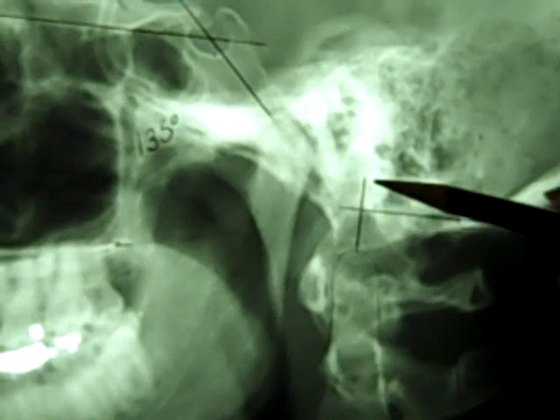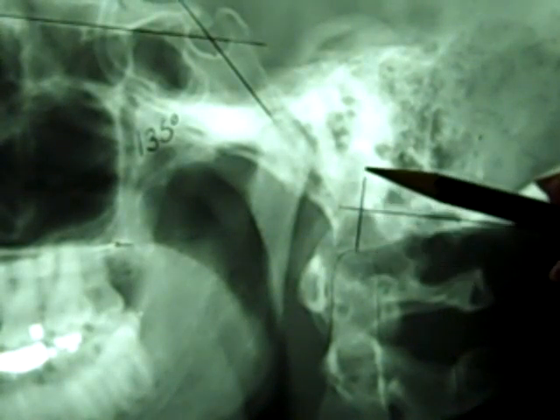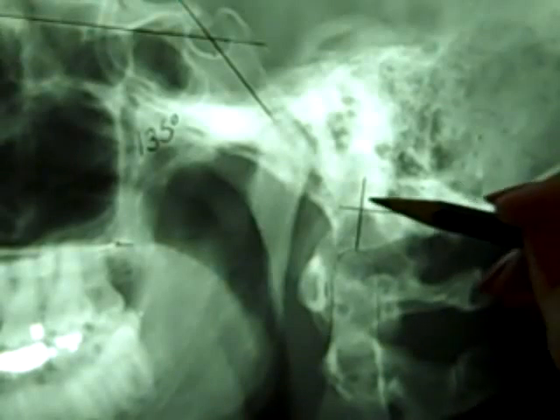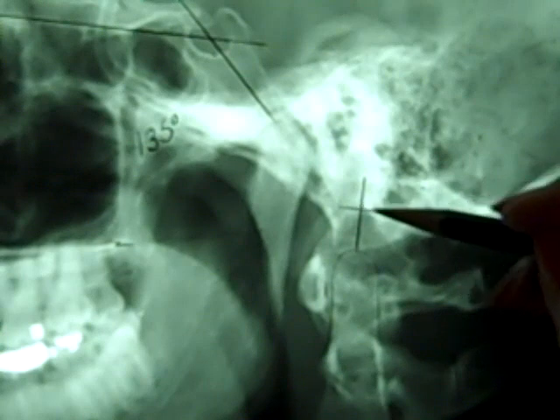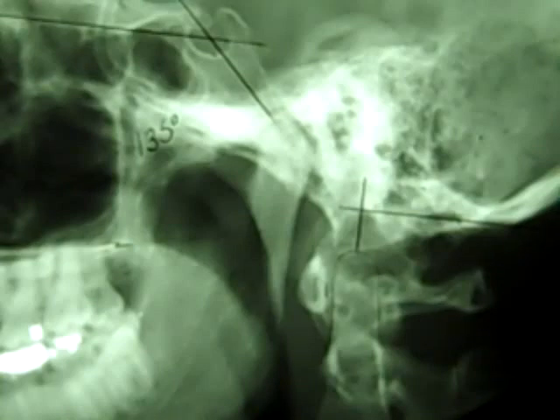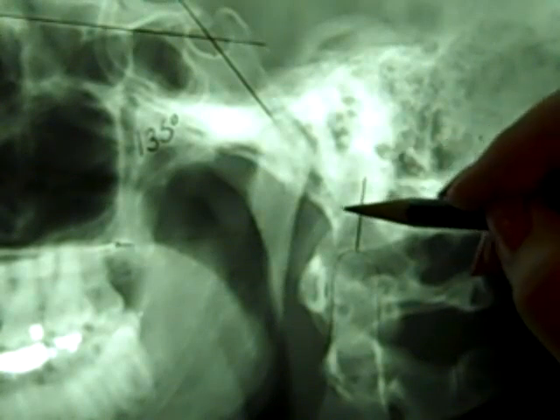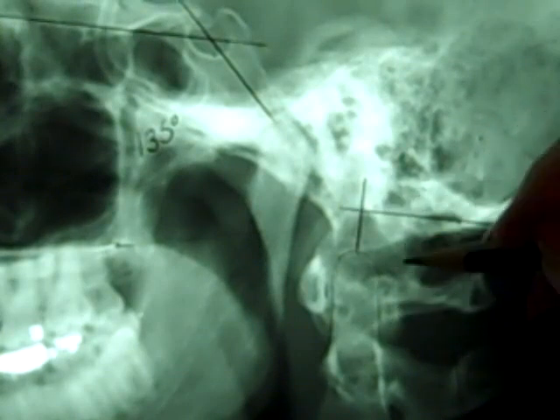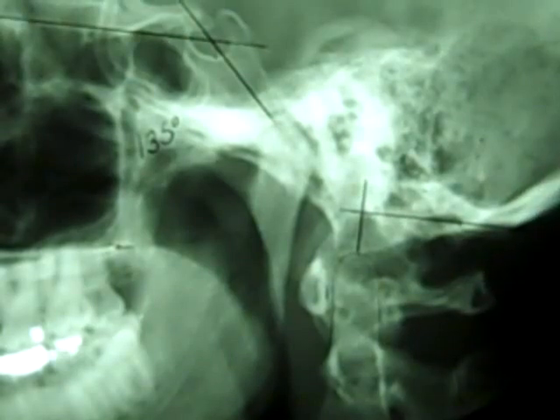The second part is that we're looking at this line, and does it fall in the anterior 1/4 of the foramen magnum? So if I'm looking at the distance from here to here, is that in the anterior 1/4? And it is. If it is not located in the anterior 1/4, we need to be worried about a fracture and/or dislocation of the odontoid process. If you're looking at this space, this is a space that should be occupied by the neural canal. We don't want to find a dens stuck back in this area. That would be bad news.